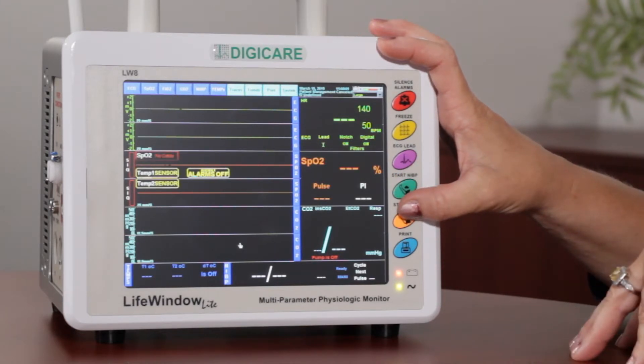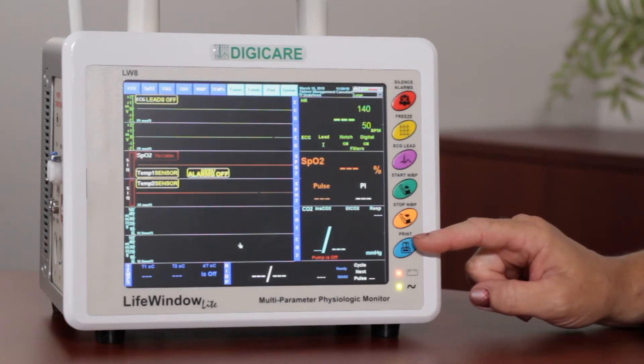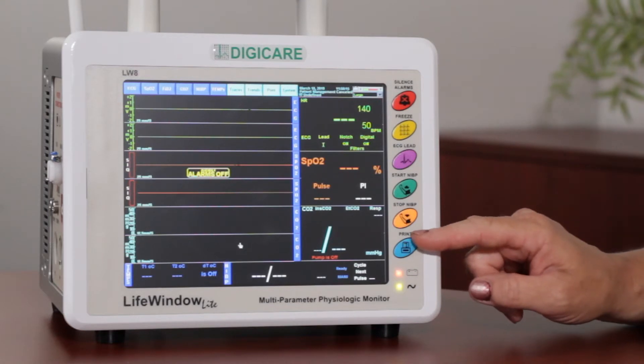The orange button is for your Stop NIBP. We also have a Print button — if your monitor is installed with a strip chart, you can easily print your ECG waveform using this button.